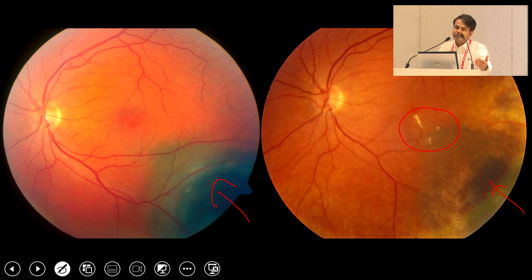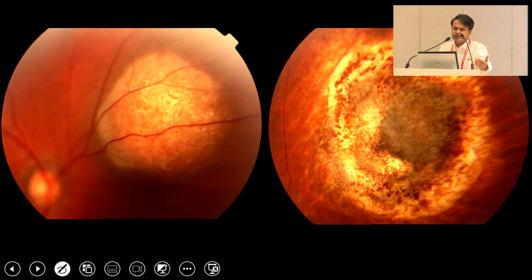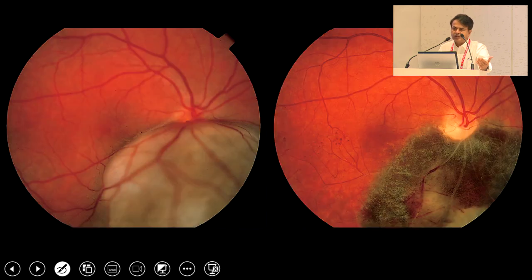Now we use preventive measures such as intravitreal ranibizumab 4 times over 1 year to prevent the complication of radiation retinopathy. Amelanotic melanoma, good outcome. Juxtapapillary tumor, you can see that there is inferior optic atrophy.